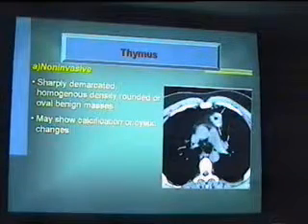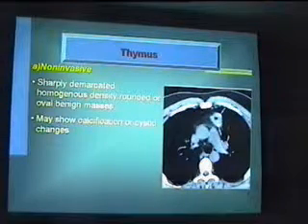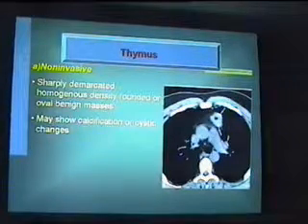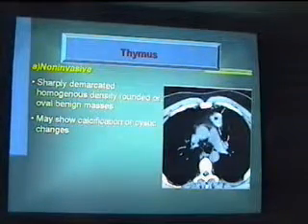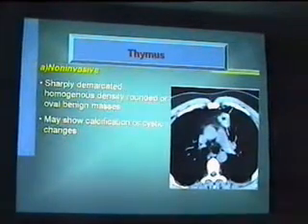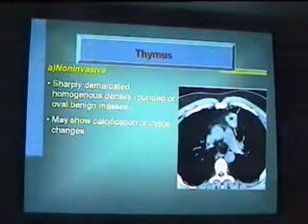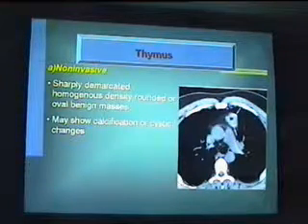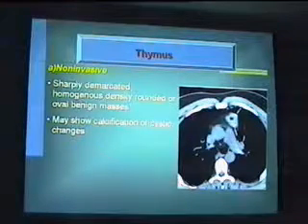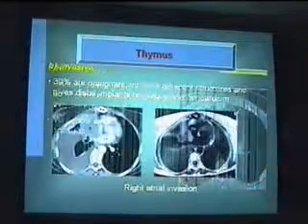وعشان كده بنحط الريجنال مع الباترن ابروتش ونحط differential diagnosis. اوكي؟ لكن في حاجات بتبقى very specific. if it's an aneurysm of the aorta, if it's a hernia for instance, if it's a cyst. يعني في حاجات very specific. لكن ماسة يجيب بكالسيفيكيشن مفيش ما يدعو ان احنا نقول ان دي ثايموما. اللهم الا اذا كان العيان ده عنده مثلا myasthenia gravis فتيجي ترجح لنا شويه ان this is a thymoma because of the companionship between myasthenia gravis وثايموما. اوكي? So this is the non-invasive form of the thymoma.